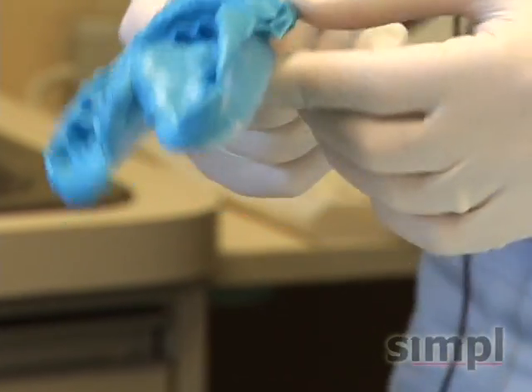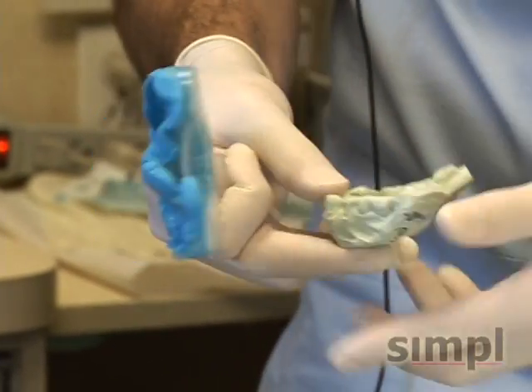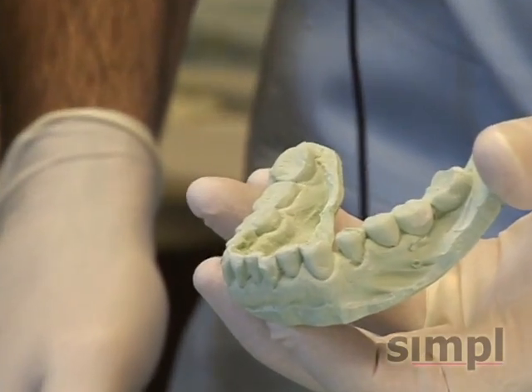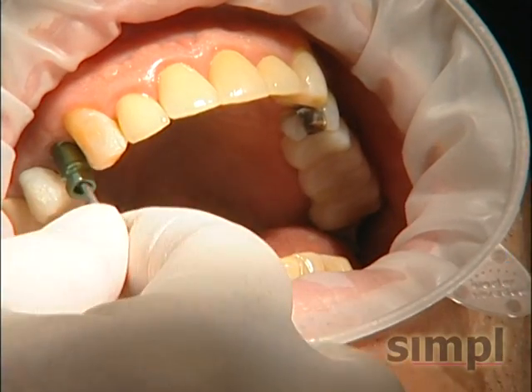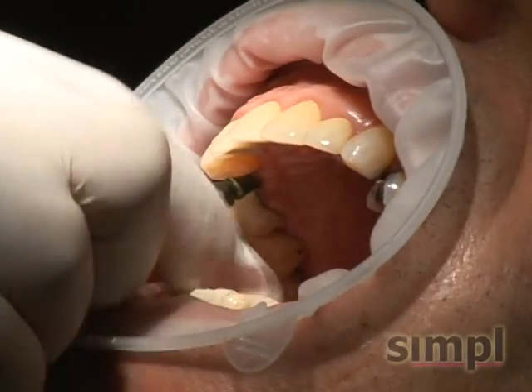We got it. A lot of good detail. So now we have our impressions. We have our counter model. Okay, and now we're going to take a bite. Put the tissue healing cap back on.